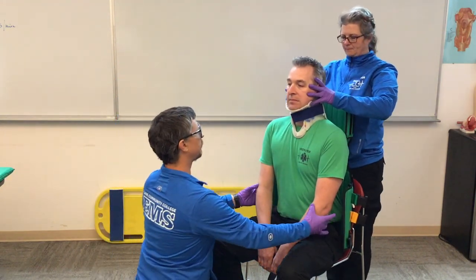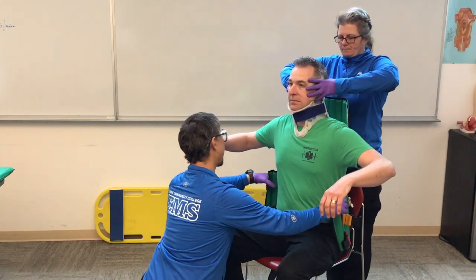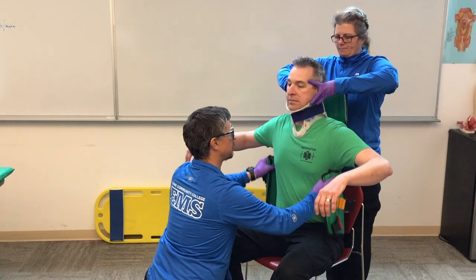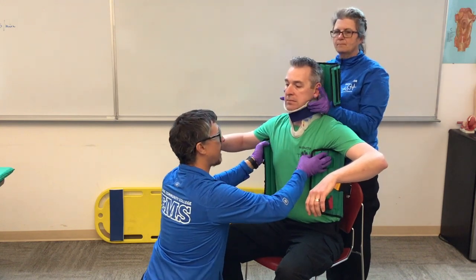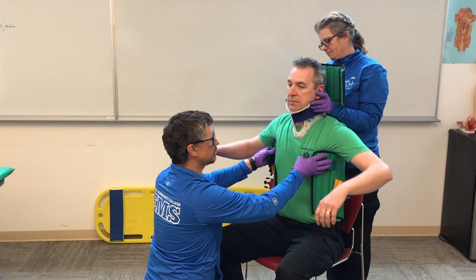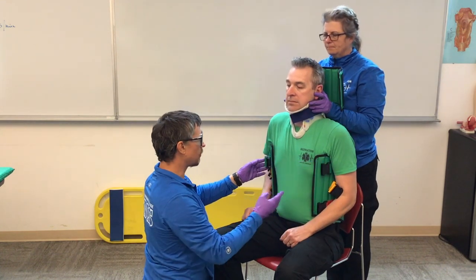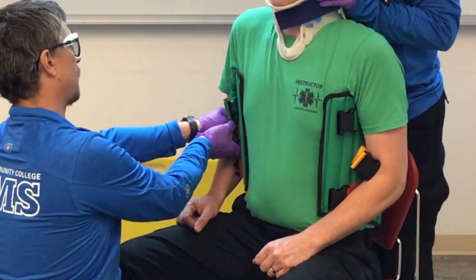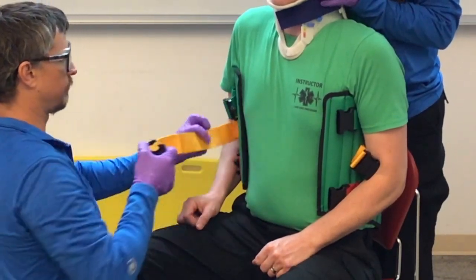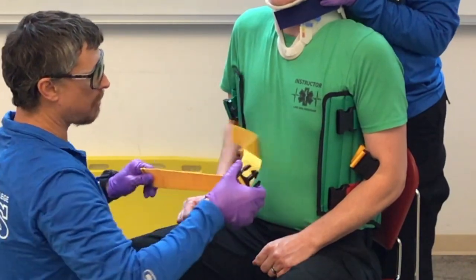Chandler, lift up your arms for me. This is going to go high and tight in the patient's armpits. If I have a cooperative patient, I can have him put his arms down and squeeze. We're going to start with the middle strap first.